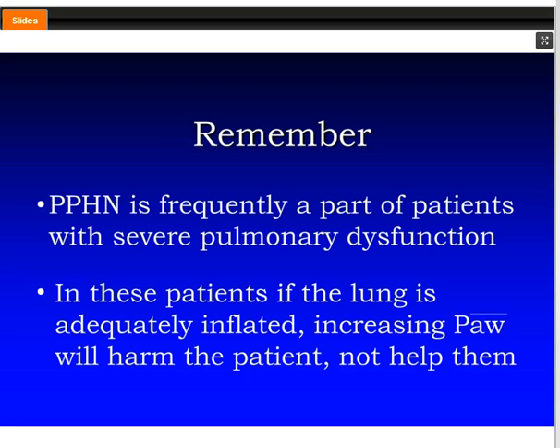Okay, you know what? We have a hospital here that says they ventilate really small babies, usually less than 800 grams. They're usually 24 to 29 weekers. Should they use higher frequencies, 12 to 15 hertz, for the first week? The answer is I have found 10 hertz to be a very ideal frequency.